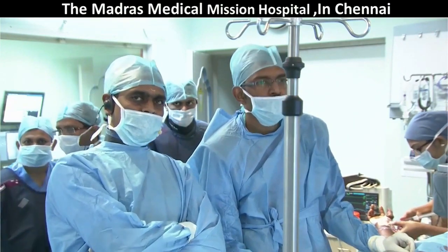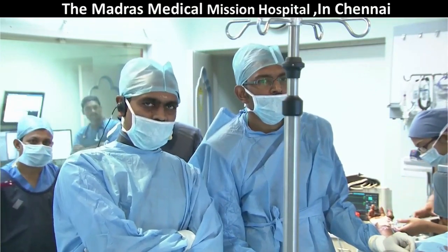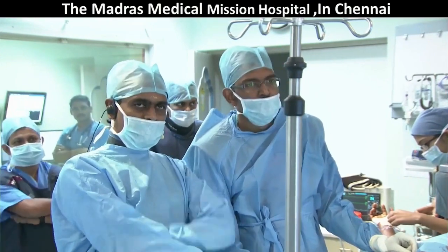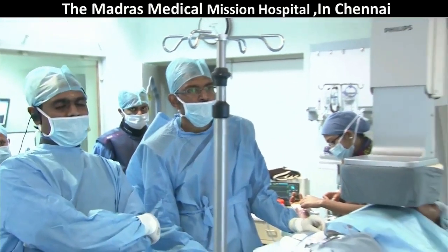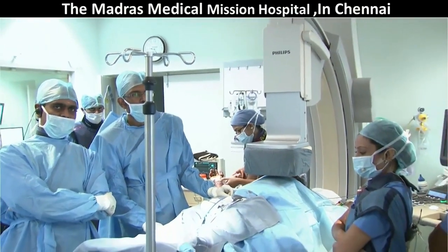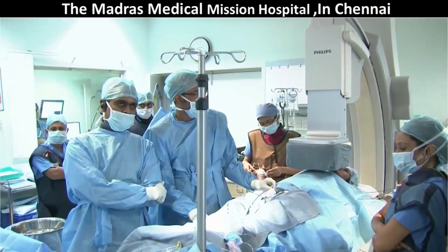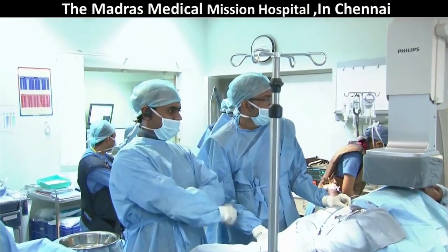Nice to start off with our patient. You just saw one intravascular ultrasound, and I thought we will show you intracardiac echo today. I have my colleague Dr. Avinash who is going to do the ASD closure, and Dr. Ramya Shri will be assisting with the intracardiac echo. And I request Dr. Sandeep, my colleague, to give the clinical scenario. Sandeep, PowerPoint.